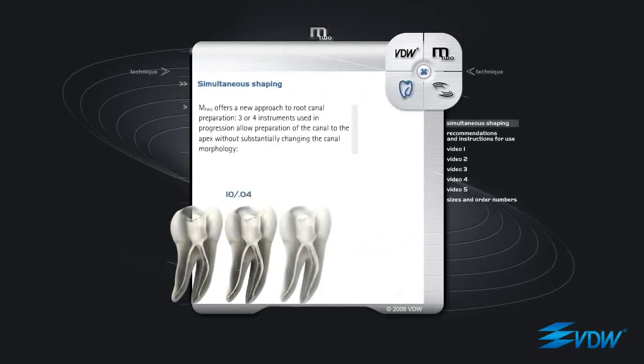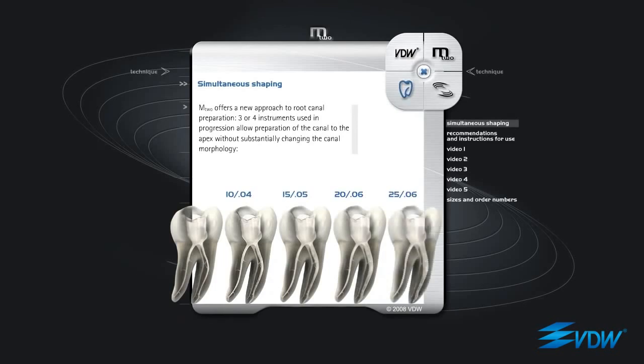Simultaneous Shaping. M2 offers a new approach to root canal preparation. Three or four instruments used in progression allow preparation of the canal to the apex without substantially changing the canal morphology.